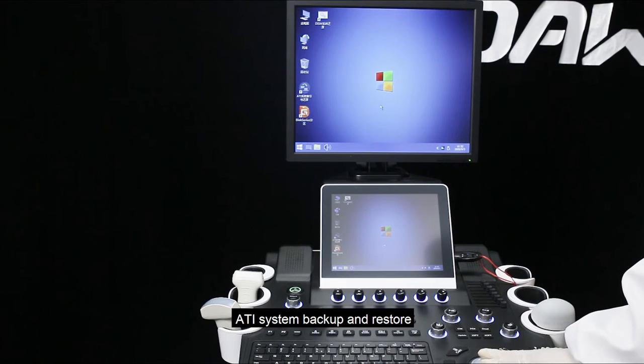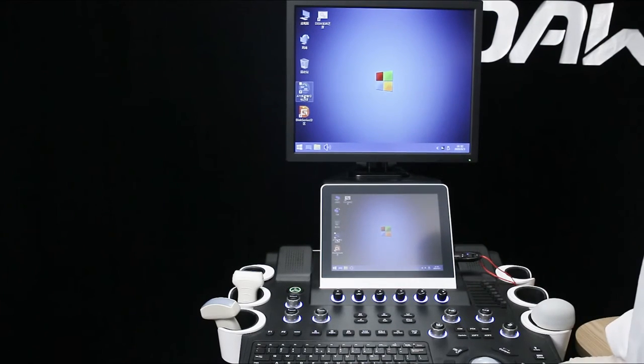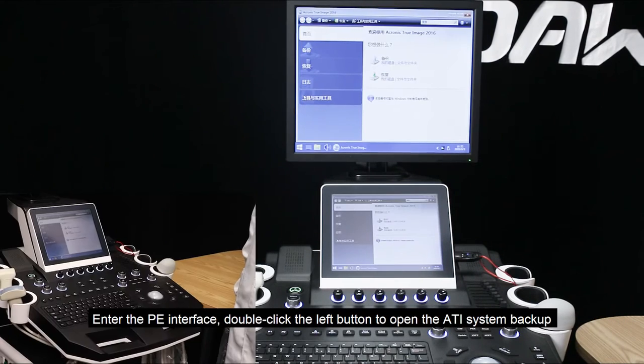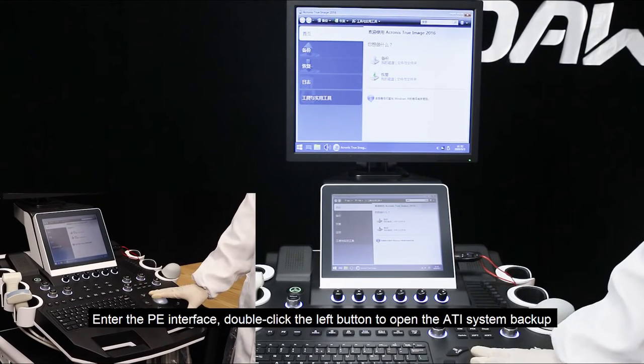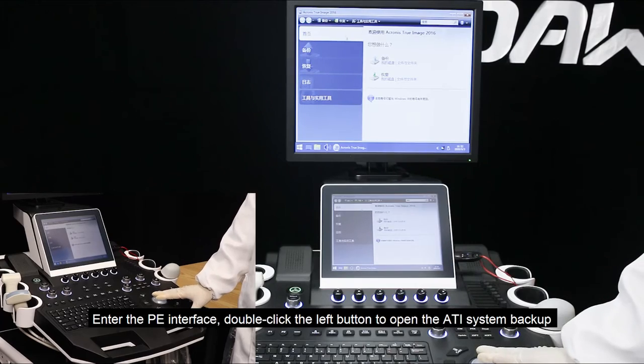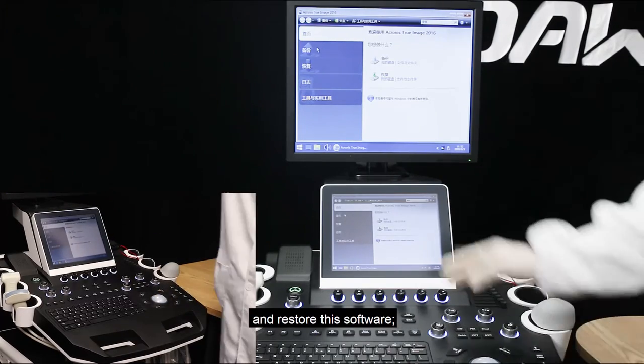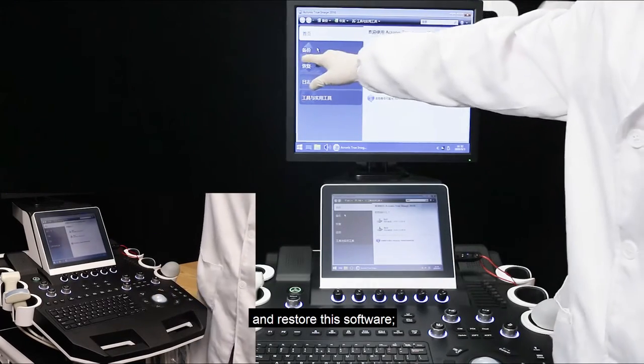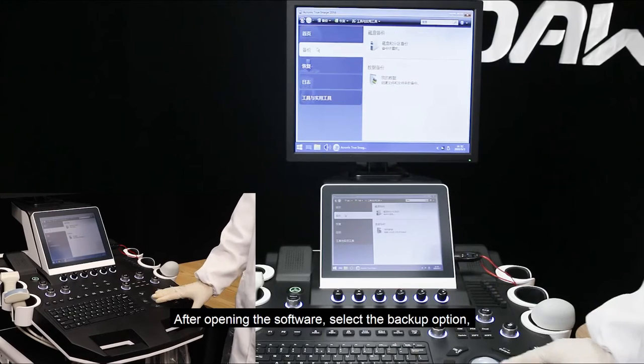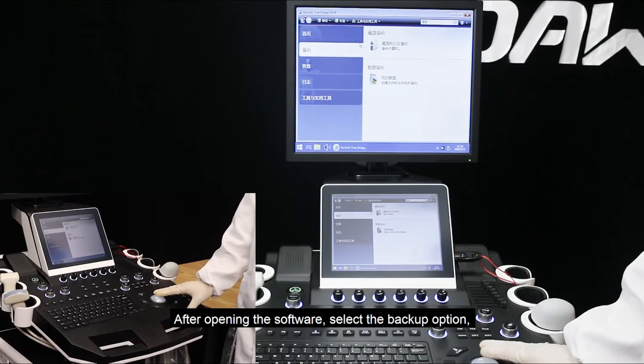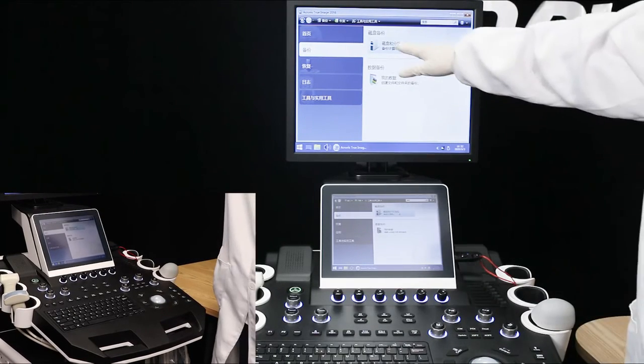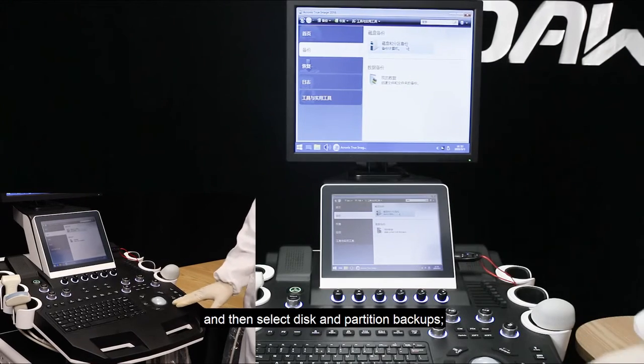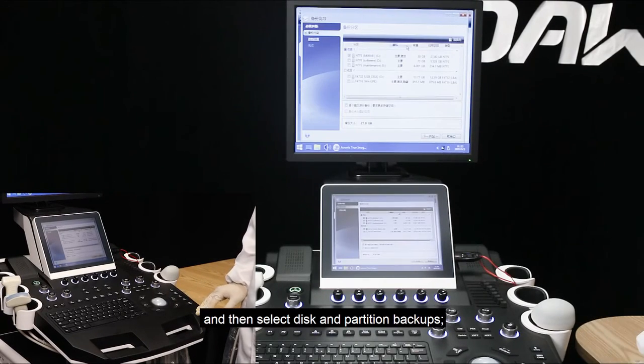ATI system backup and restore. Enter the PE interface. Double click the left button to open the ATI system backup and restore software. After opening the software, select the backup option, and then select disk and partition backups.